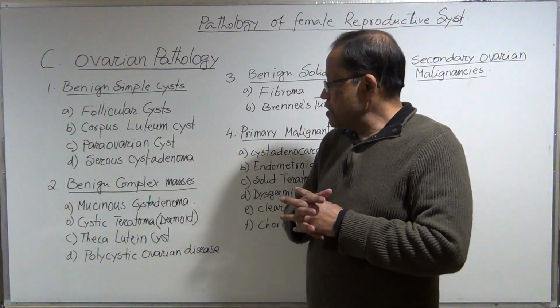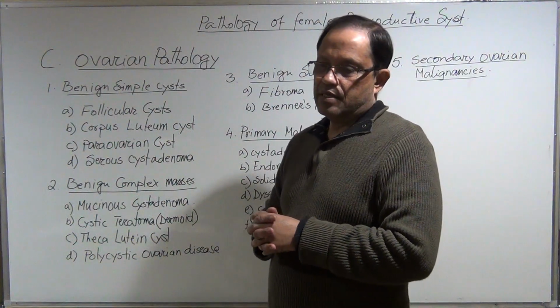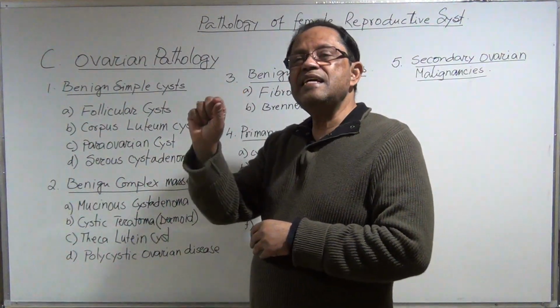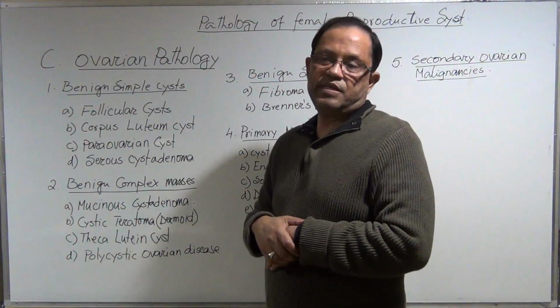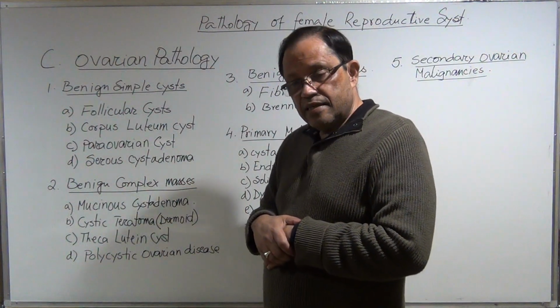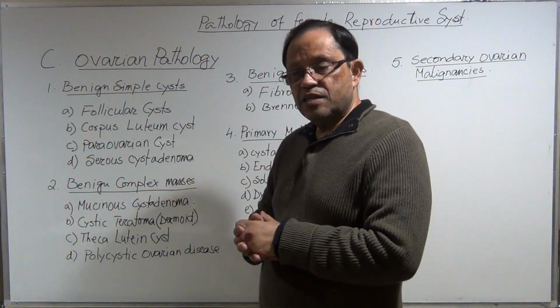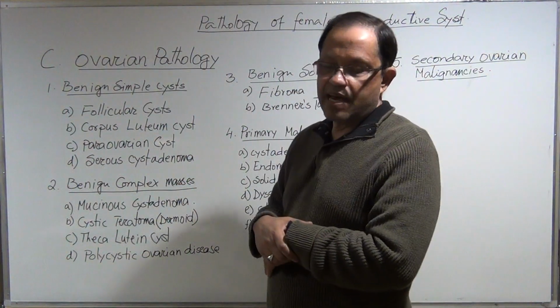That adenoma, serous cyst adenoma, usually unilocular, and the wall is thinner, less than 2 millimeter, uniloculated, should not have septation inside.